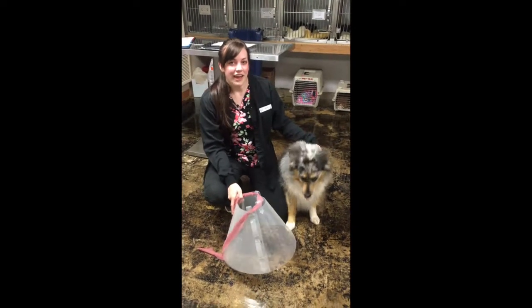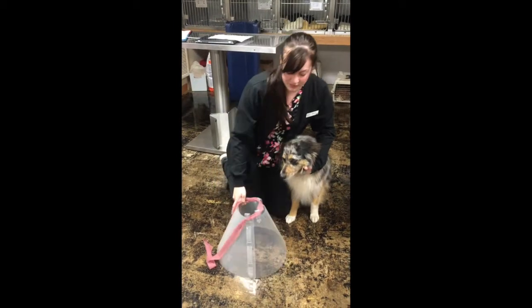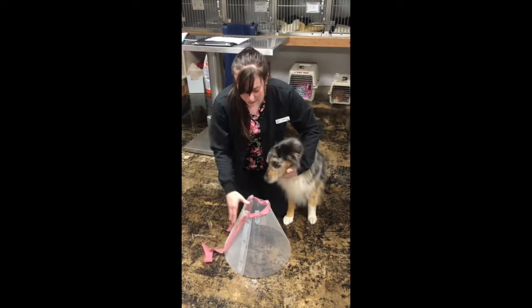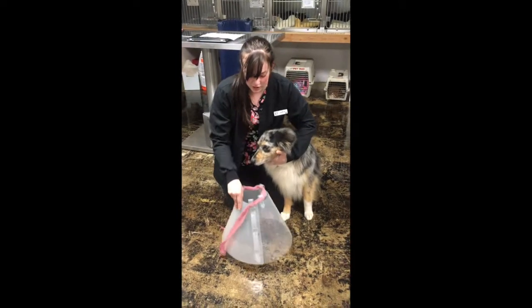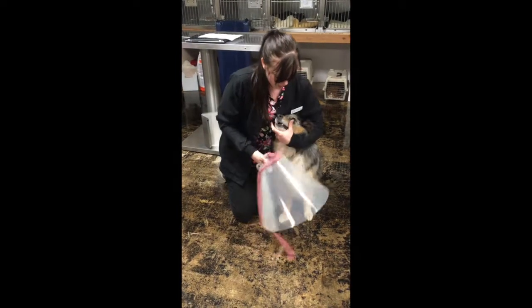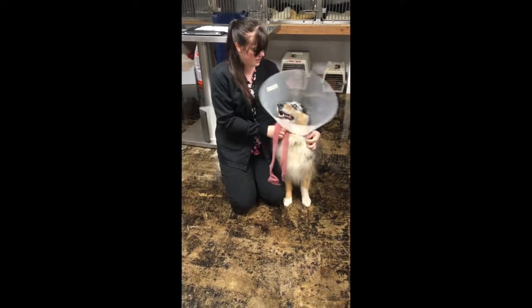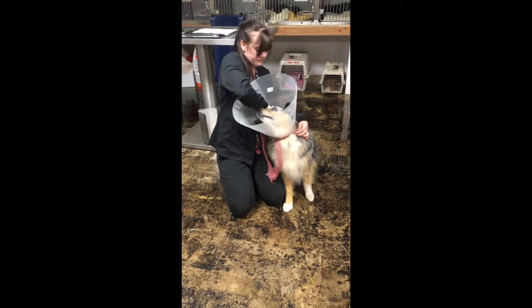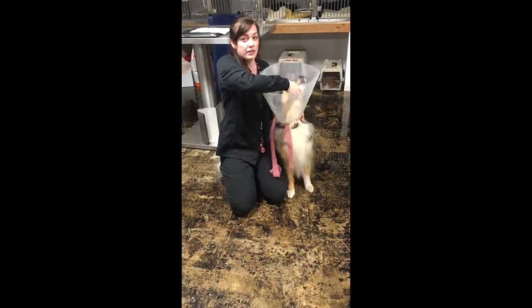I'm going to be demonstrating how to apply an Elizabethan collar to a patient. So I have Bailey here, and I have chosen a size 30E collar for her. I've got it all put together, it's woven through, and it's not going to go anywhere. It's nice and secure. I'm going to go ahead and slide it over her face, making sure that the prongs don't touch her eyes. Pull your ears through. You can see that when her neck is stretched out, her nose does not come out past the outside of the collar, and that's what we want.